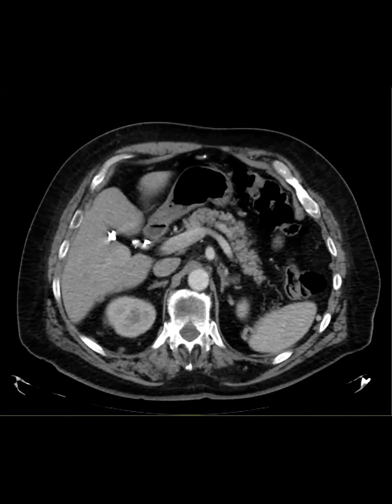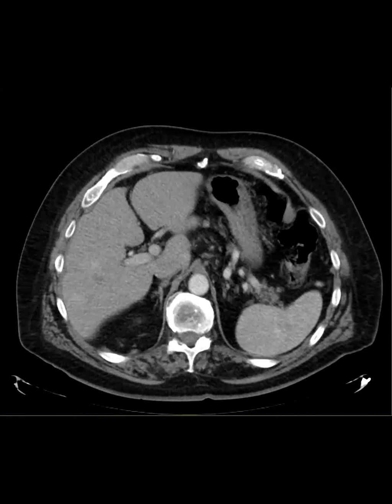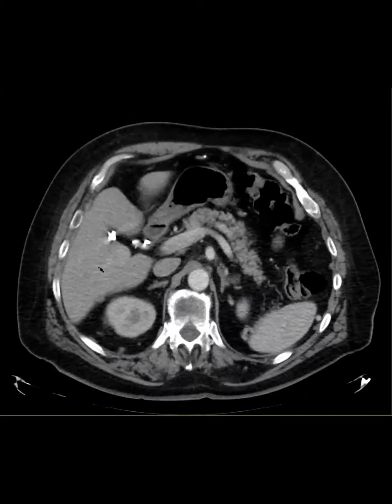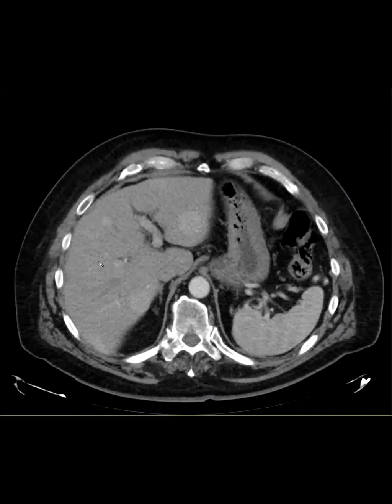Aarti, is there any molecular imaging on this case? No. Okay. It's a fairly recent case, but I bet they'll follow them up with DOTATATE scans.